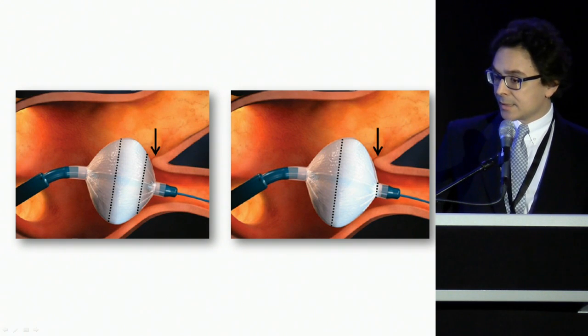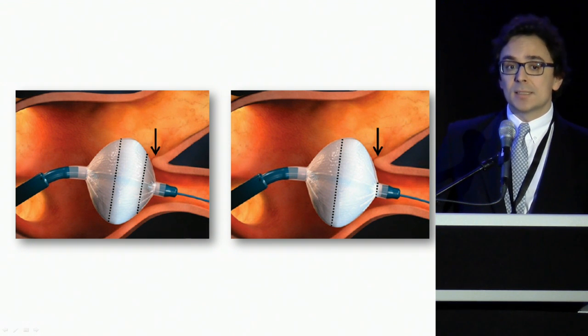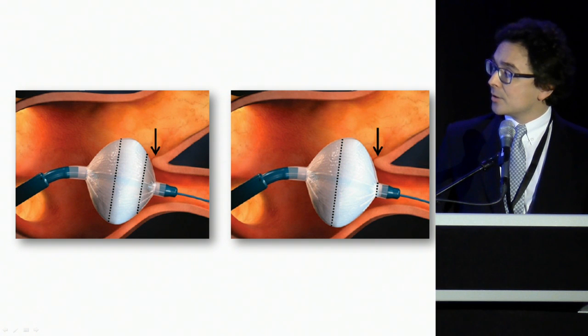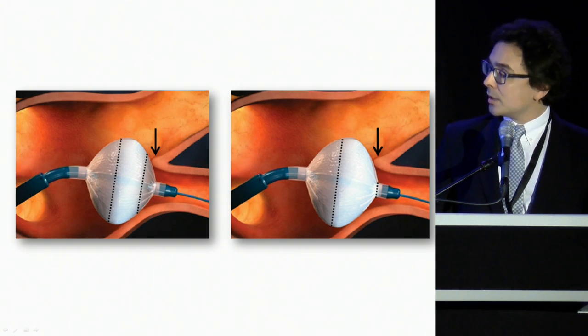Again, just to summarize these ideas that cryoballoon users know very well, the cryoballoon is based on getting occlusion of the pulmonary vein. It's actually an anatomically based approach to PVI. Now, the occlusion is the best indirect parameter to guarantee isolation. What you see here is that if you would inject contrast, you would have occlusion with both the first generation and the second generation balloon. But in the case of the first generation balloon, what you would probably have is an area of suboptimal freezing in the interpulmonary carina that we all know is extremely important in terms of triggering atrial fibrillation.